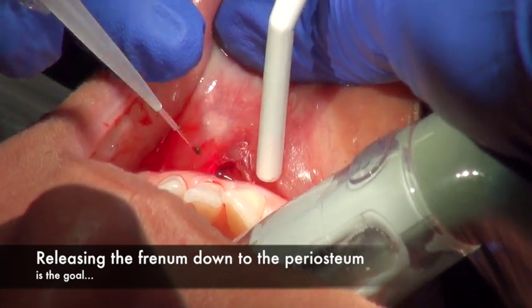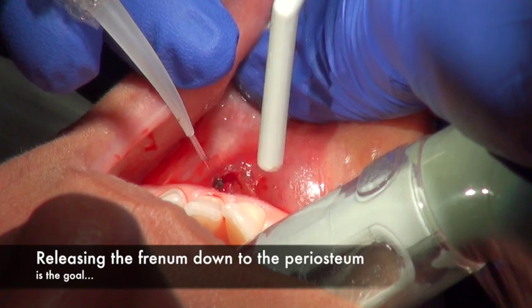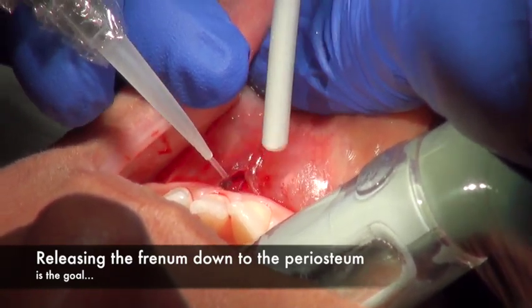Yeah, but you don't touch the periosteum. Okay. Around the bone, right? Periosteum. See right there, it's framing. Still an attachment.